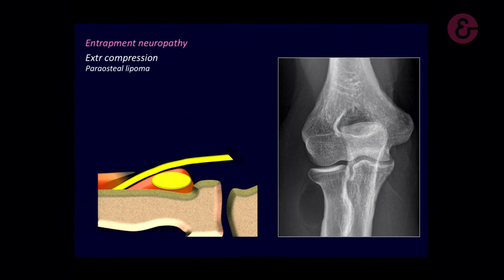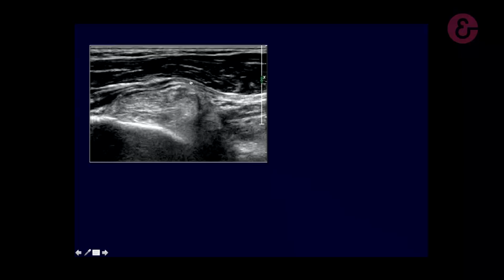And if you like the details as I like, you can see this small fat stripe, which is the supinator fat stripe, which is the fat located over the supinator. So you can say the mass is inside the supinator, in the X-ray. This is the longitudinal, you can see, look, this is the nerve coming and pushed against the Frohse arcade by the lipoma.